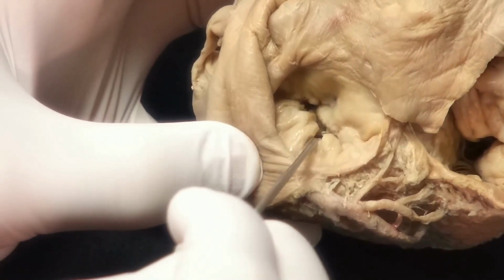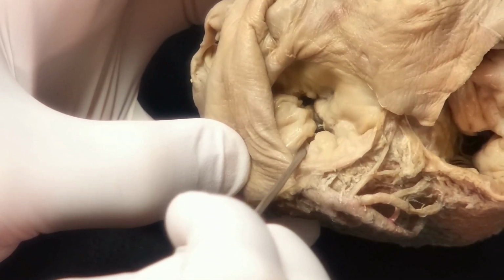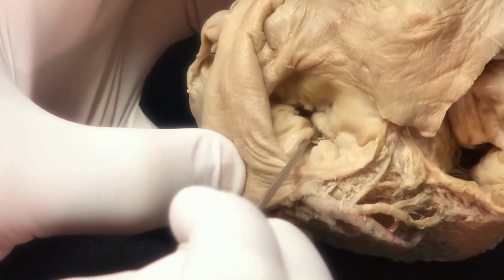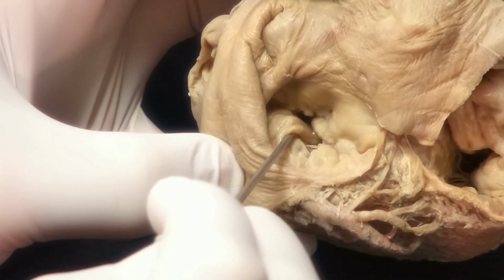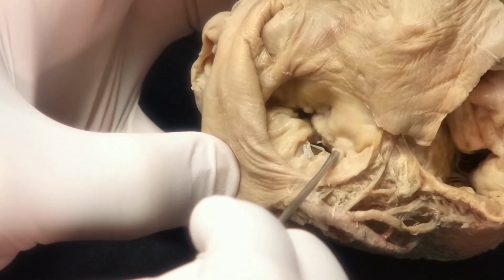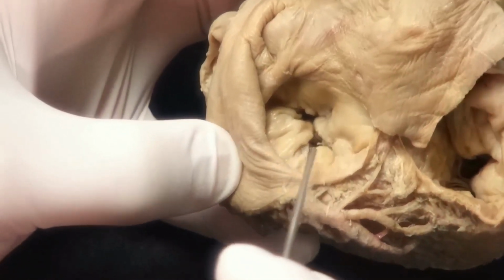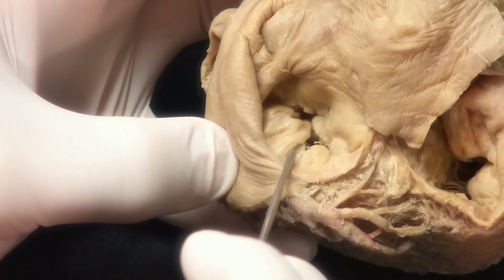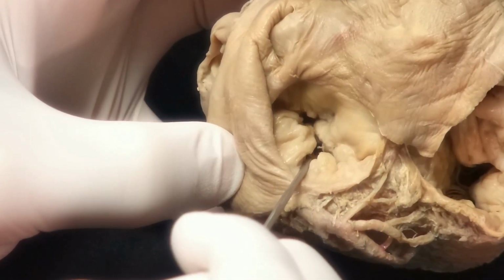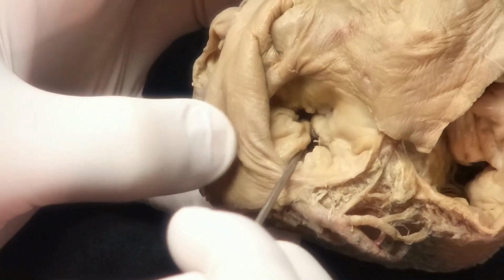Now, admittedly, from above, if you look at this space here, it does look like a division between the leaflet tissue that runs all the way to the annulus. But in fact, that's just an accentuation of the normal folds within the leaflet. You can see there's thin leaflet tissue running underneath that's supported by cords. And it's created by a hooding and a thickening of the leaflet tissue on either side. So that creates this potential division, and you may well get regurgitation through this region, of course.